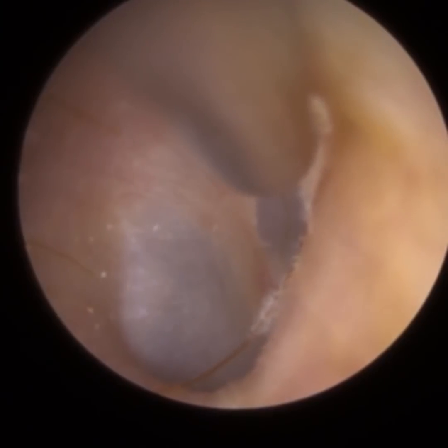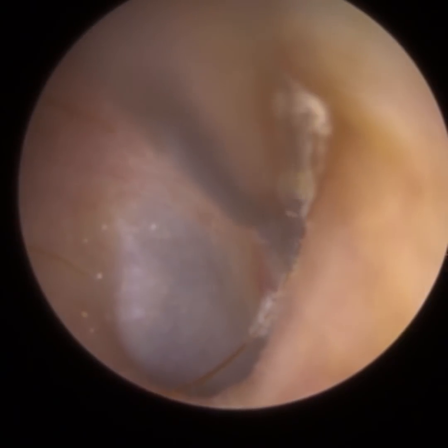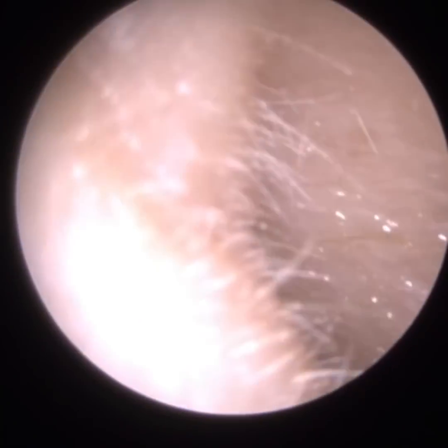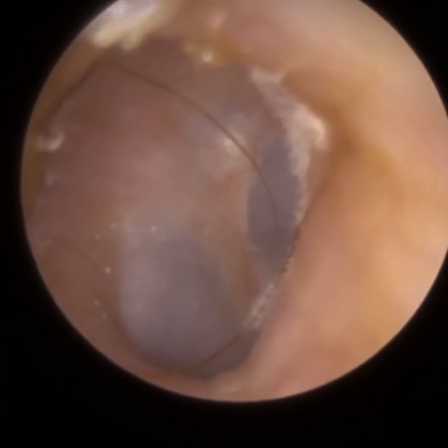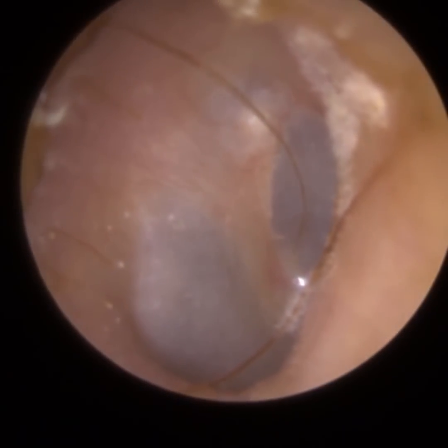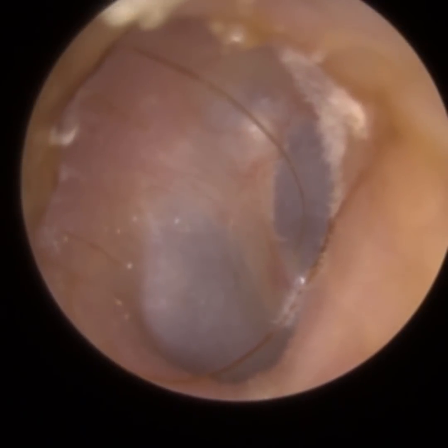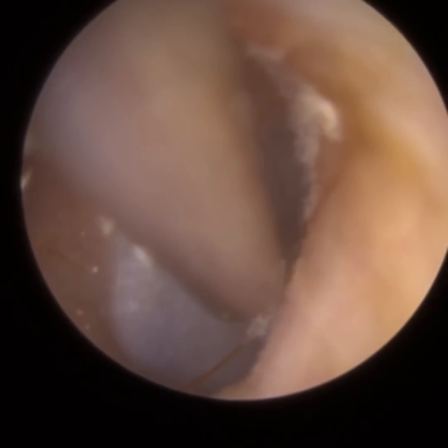Now, it is very tricky getting this patient's ear. He's got a very narrow, twisted ear, as I mentioned. The cartilage is quite thick as well, so I've had to bend the fine end tip just to get access onto this anterior canal wall. So that's not cotton wool. The patient has used cotton wool in the past, which I gave him a slap on the wrist for because he knows better not to. But this is fungal spores, otomycosis.